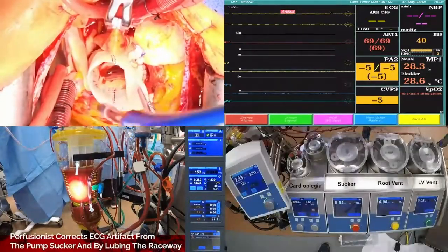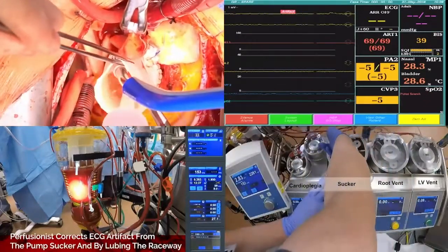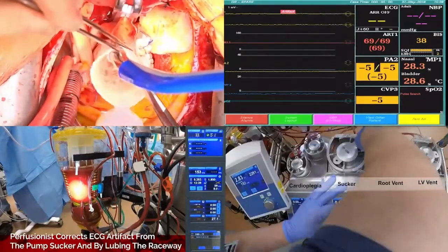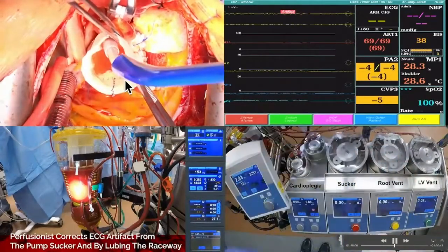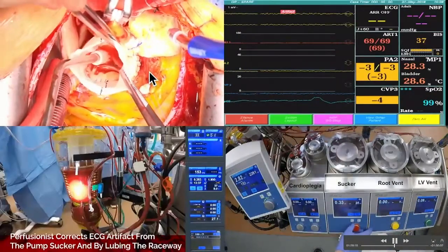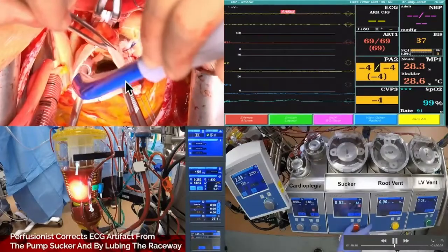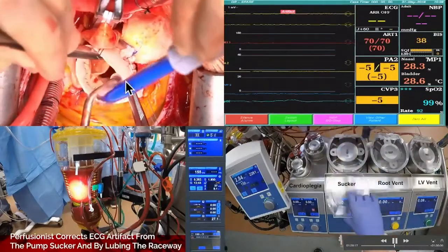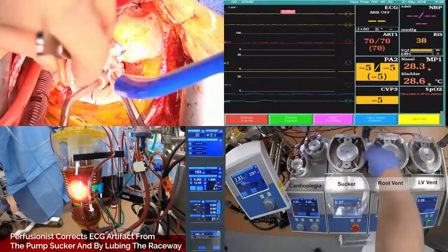That's the cell saver sucker, with the light. The one at 3 o'clock is the lighted cell saver sucker. It's different than a regular one. All right. Just watch it jam. Watch it jam. There it goes. It just jammed. I saw the pump head pop up. And he's like, oh, shoot. Now what am I going to do? Oh, let me turn it backwards.